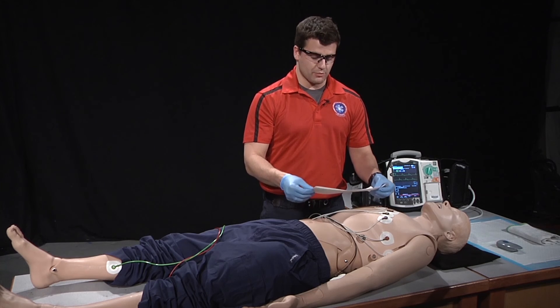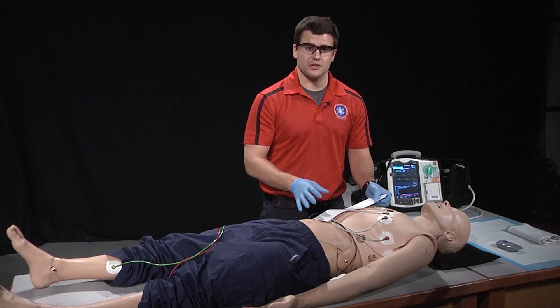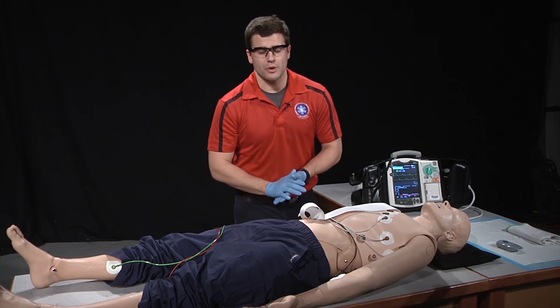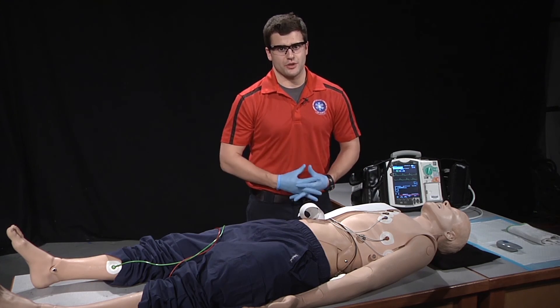Once the cardiac monitor has printed the 12-lead, we're going to interpret the 12-lead to our local standards as well as report any findings. After this, for any unstable patient, we want to have serial 12-leads every 5 minutes and also after any intervention that we perform.